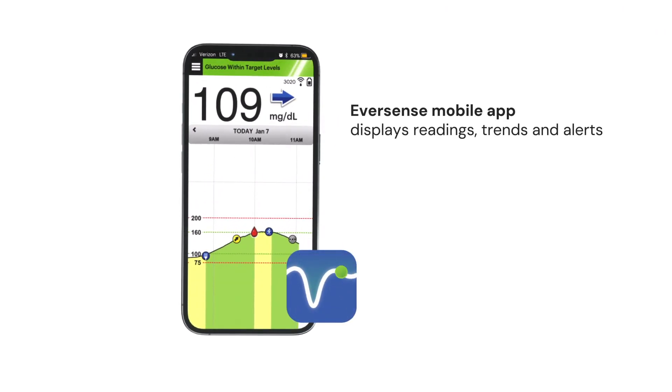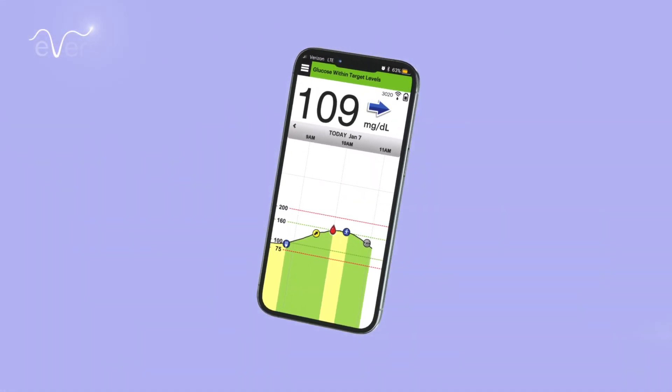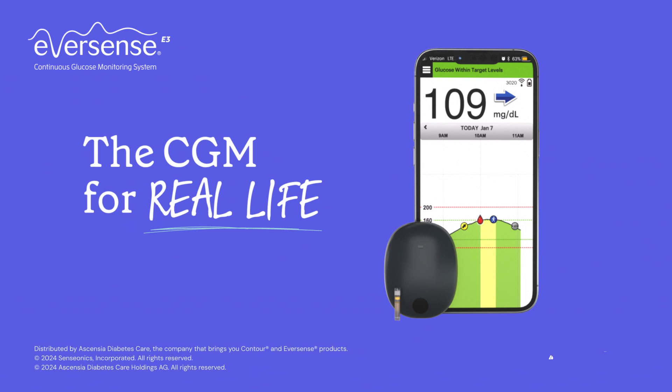The Eversense mobile app displays and updates real-time glucose readings every five minutes, showing if the user is in or out of range. Eversense E3 — the only long-term six-month CGM system.